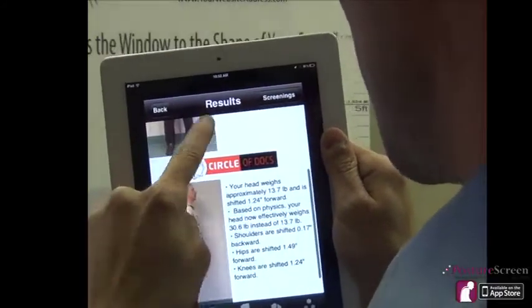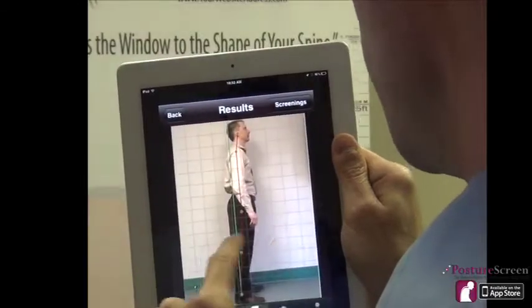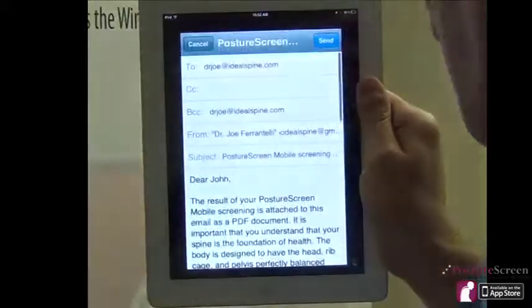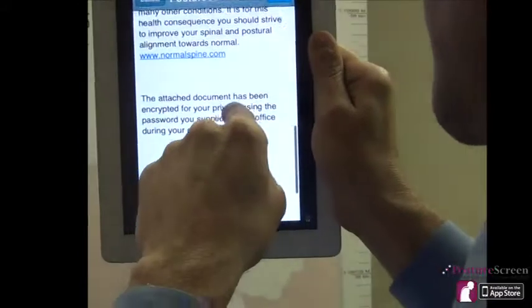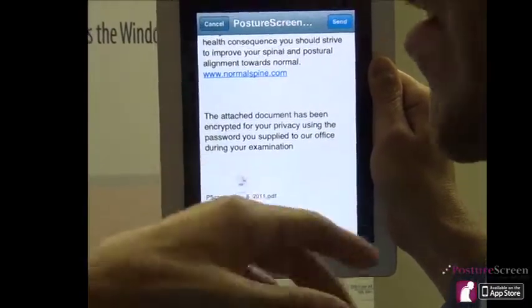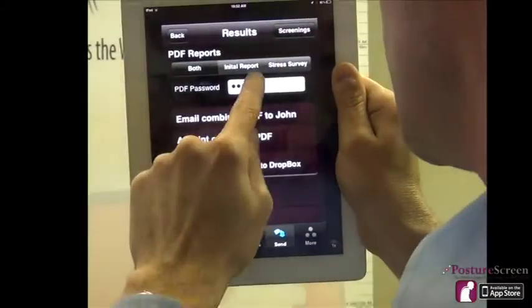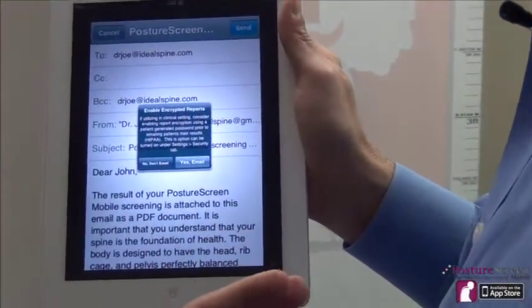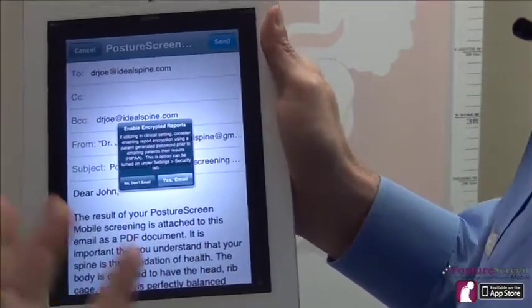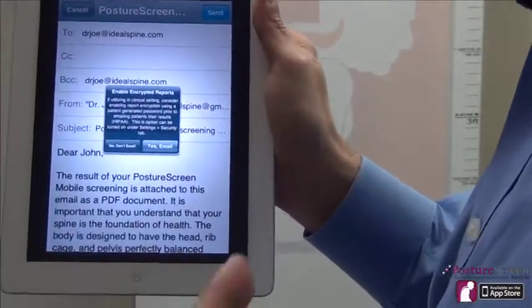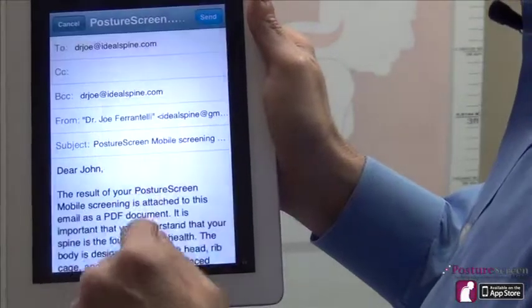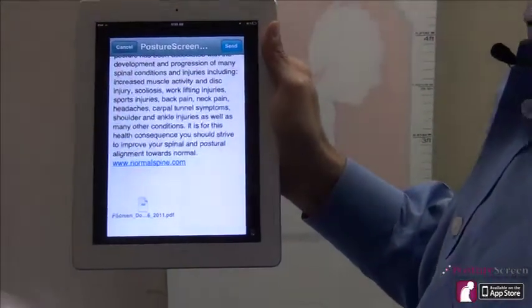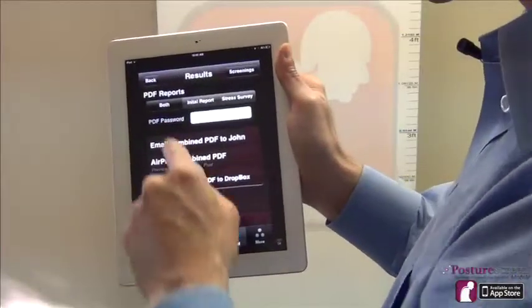At this point we can go ahead and show the patient their analysis. Here's their password. If you forgot to put a password in, you can still do so before emailing. Once we email, it's going to generate the report, and at the bottom it says the attached document has been encrypted for the patient's privacy. However, if you delete the password and don't use one, you're going to get a prompt — which you can also hide in settings — that basically says if you're using this in a clinical setting, you might consider using PDF encryption. It's purely optional.